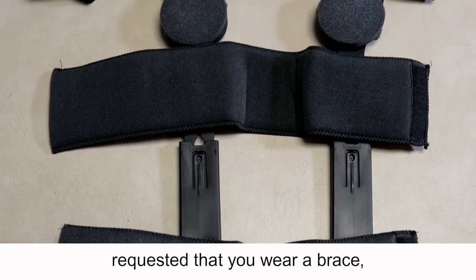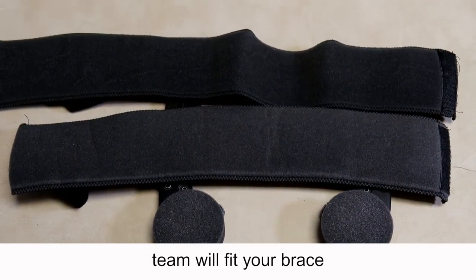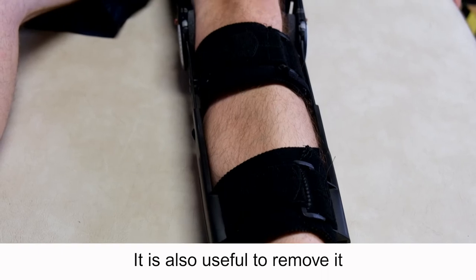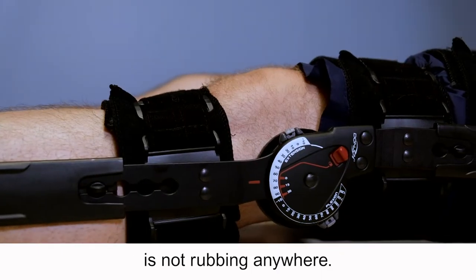If your consultant has requested that you wear a brace, a member of the physiotherapy team will fit your brace following surgery. The brace is not waterproof so you will need to remove it when you are having a wash. It is also useful to remove it regularly to check your skin and ensure the brace is not rubbing anywhere.